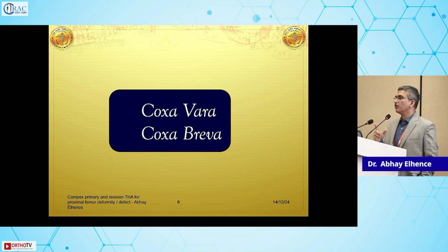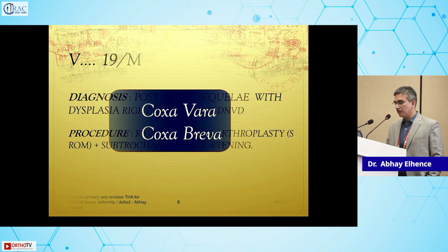And that is something we don't see very often, but that essentially says you have a higher offset stem available on the table. And you plan to restore the offset, both the vertical offset as well as the horizontal offset. So that balance is very, very important.